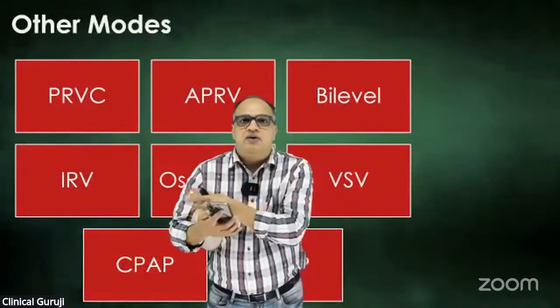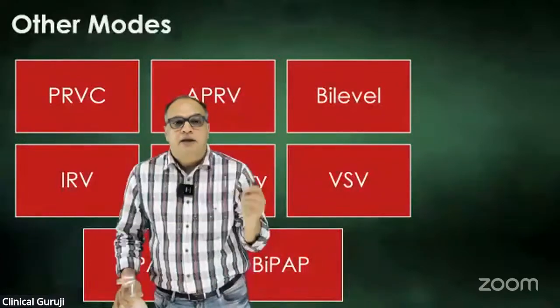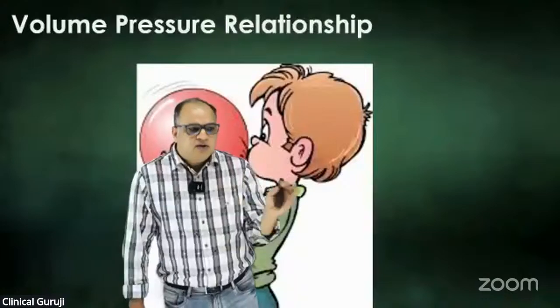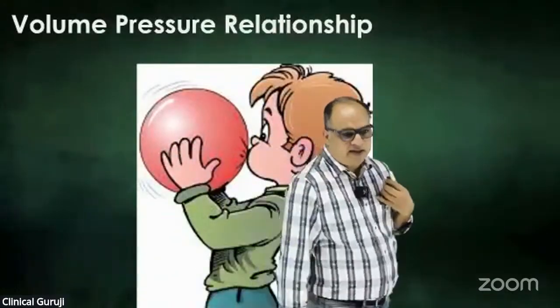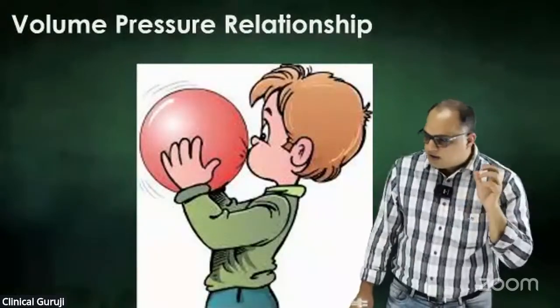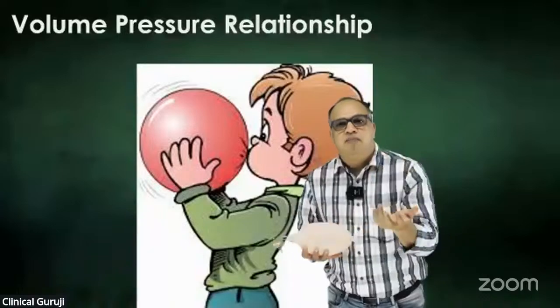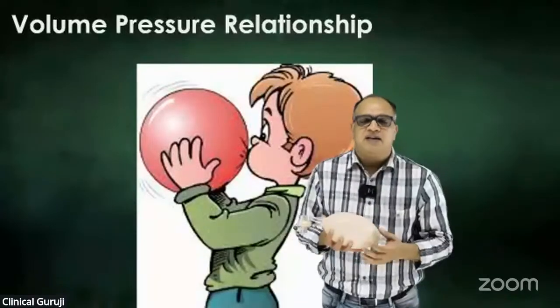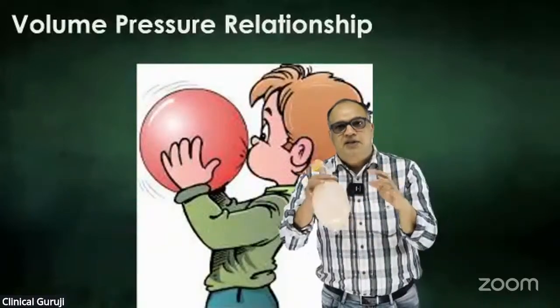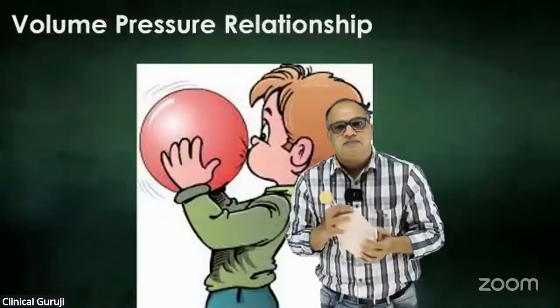We didn't decide on pressure control or volume control. They are not exactly modes of ventilation. Now let's understand something different. Your lungs are like balloons. And when you push air into a balloon, or your lungs for that matter, you are generating some pressure on the walls of the balloon or the lungs.